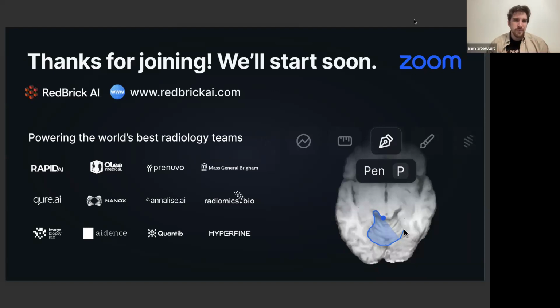Many annotation platforms out there are what we call more horizontal, in the sense that they try to address a wide variety of annotation use cases for a wide range of industry practices, right? But we're very happy in our medical niche. We work in very close contact with the clinicians and the radiologists and the annotation teams that are performing work on our platform to create, design and develop specifically for AI products that will enter into clinical use.